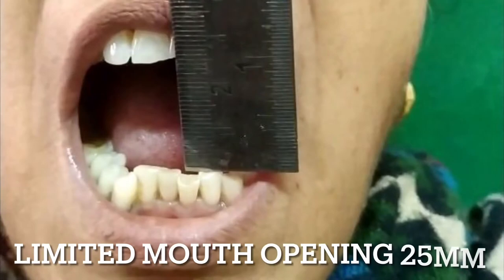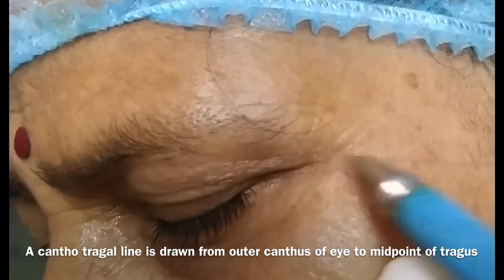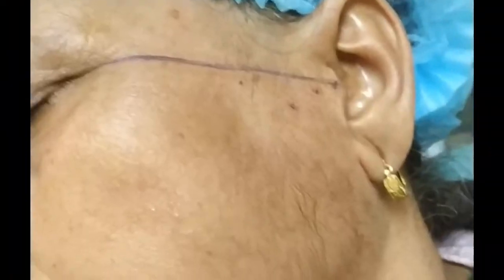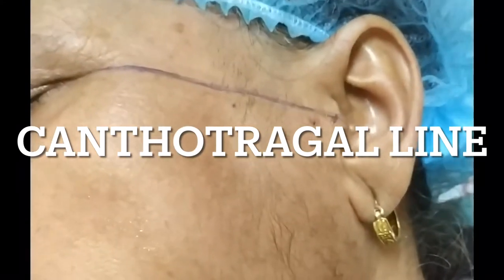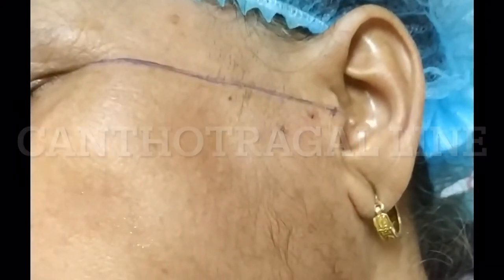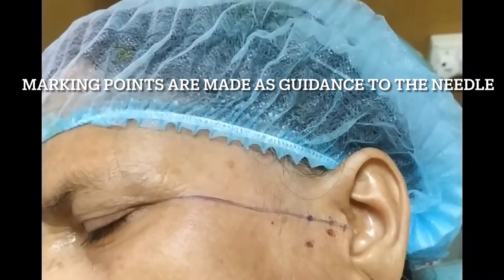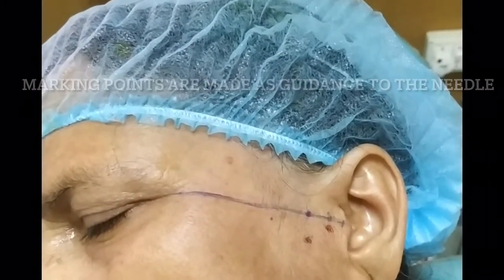You can see there is severe decrease in mouth opening. Since I did not have a marker, I've drawn with a pen. Firstly, we're going to draw a cantero-tragus line from the outer canthus of the eye to the mid-tragus region. These are the markings used as guidance to the needle through which we are going to perform lavage to the TMJ region.